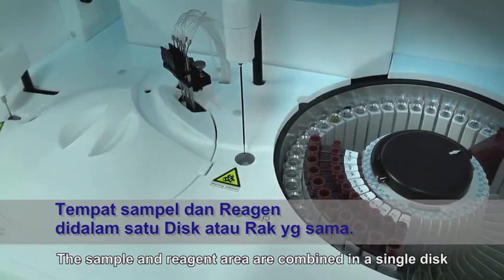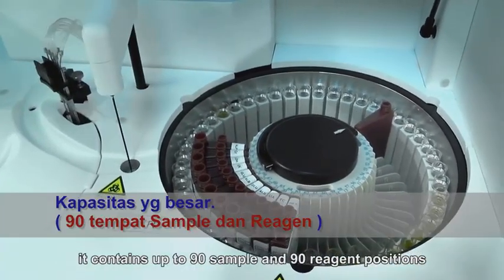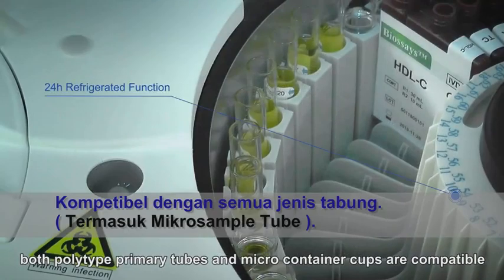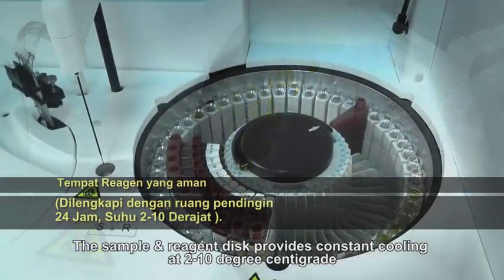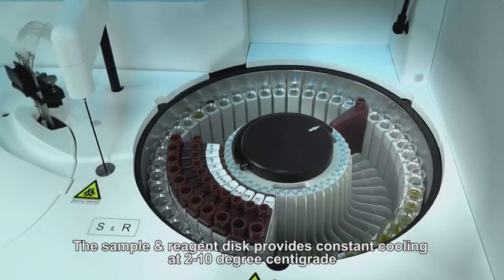The sample and reagent area are combined in a single disc, containing up to 90 sample and 90 reagent positions. Both polypropylene primary tubes and microcontainer cups are compatible. The sample and reagent disc provides constant cooling at 2 to 10 degrees centigrade.